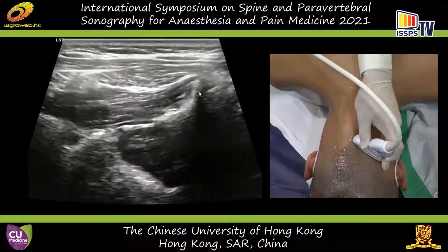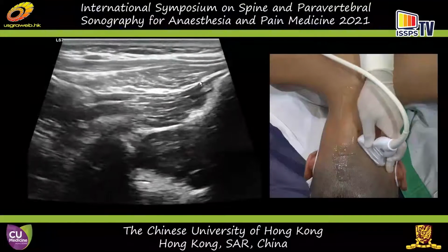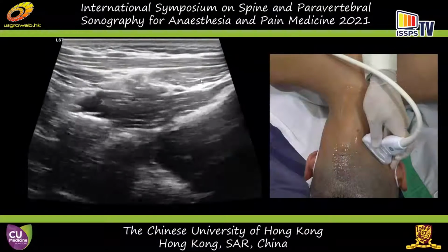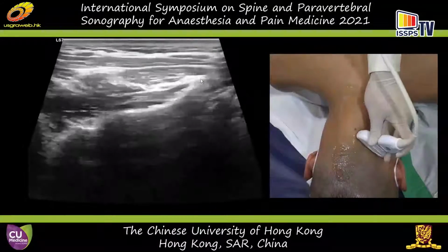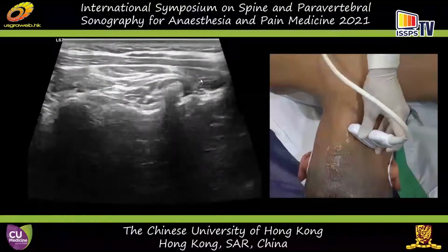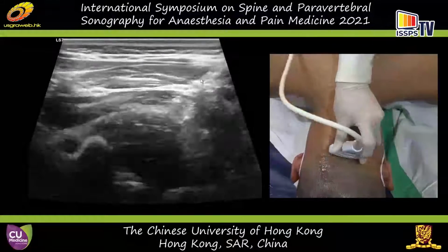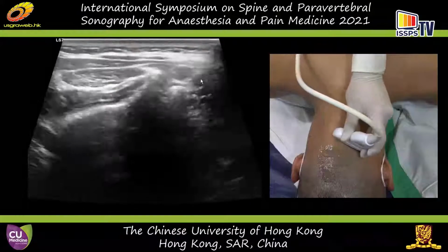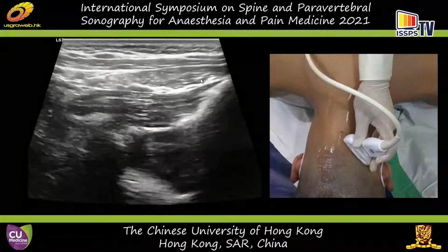I come from the C2 spinous process and then go to the C1 transverse process, right here. From the C2 spinous process and then to the C1 transverse process.